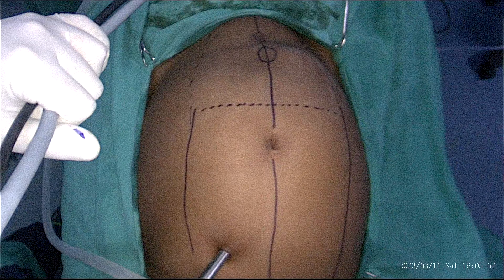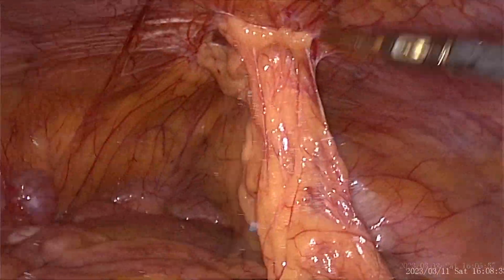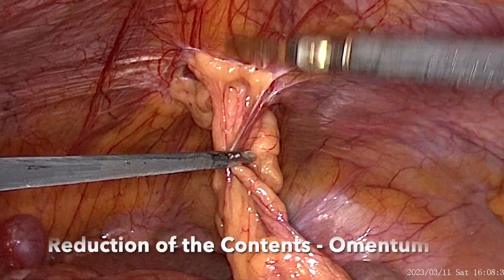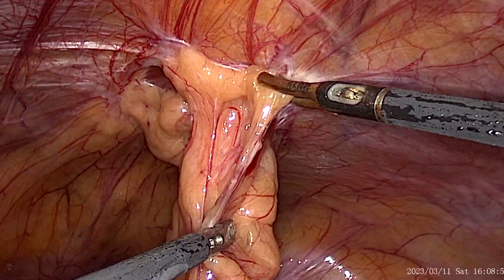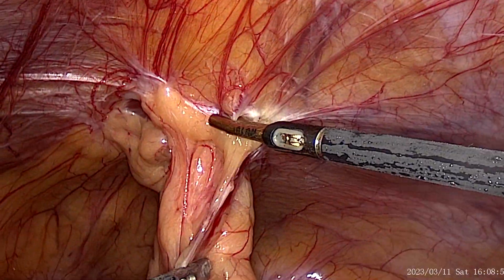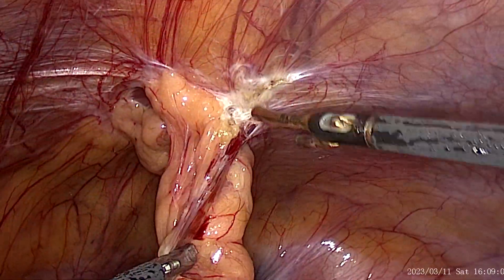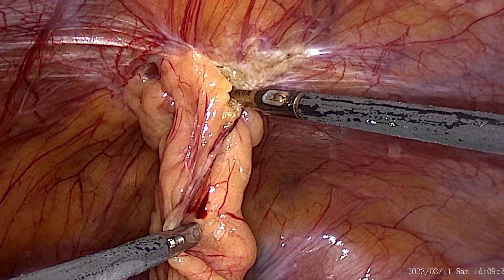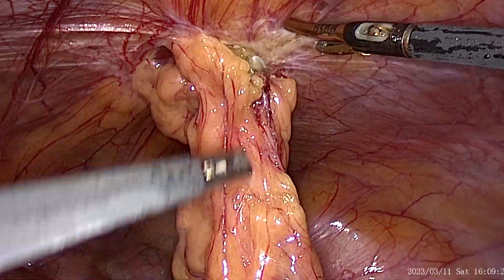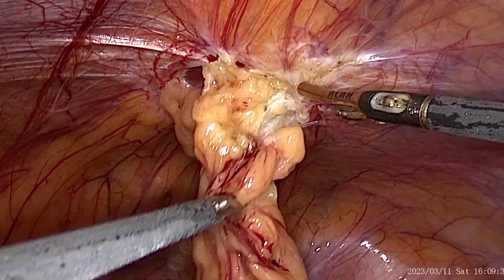The flap and the mesh area are marked with a dotted line. The omentum is dissected from the defect using a bipolar device or a vessel sealing device.